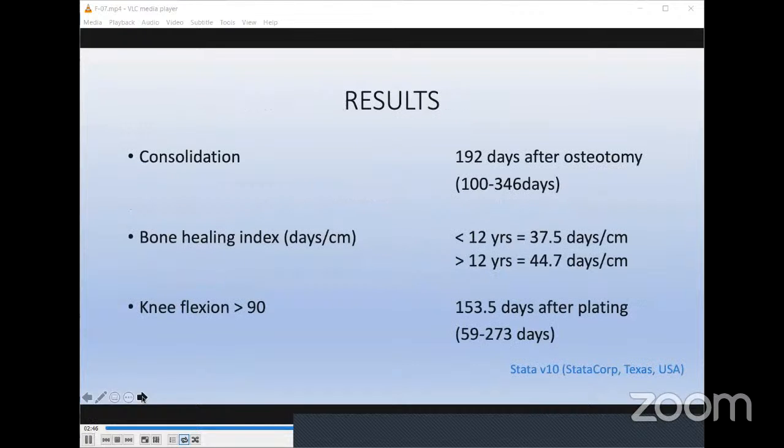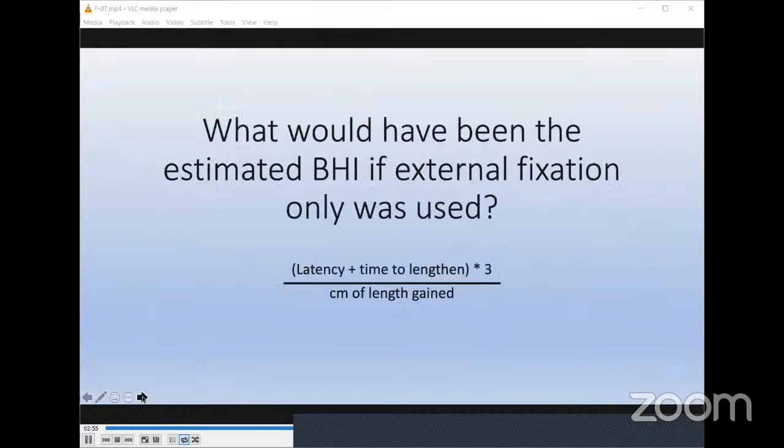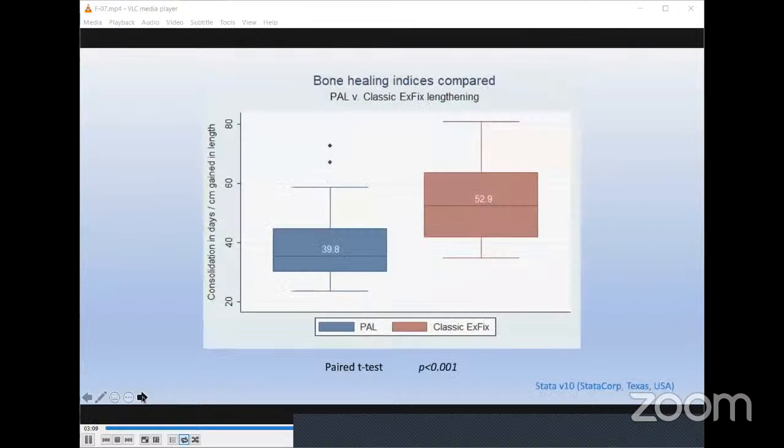Consolidation was seen in 192 days following the osteotomy. Bone healing index was better in children younger than 12 years. Knee flexion of more than 90 degrees was achieved in 153 days. We estimated the bone healing index if the lengthening was done only with an external fixator, as 3 times the total time to lengthen, including the latency period, upon the centimeters of length gained. Improvement of bone healing index in our plating after lengthening was statistically significant, suggesting that bone was healing faster with our technique.